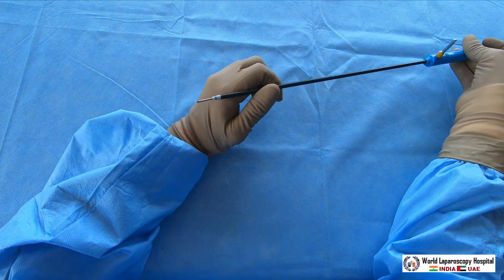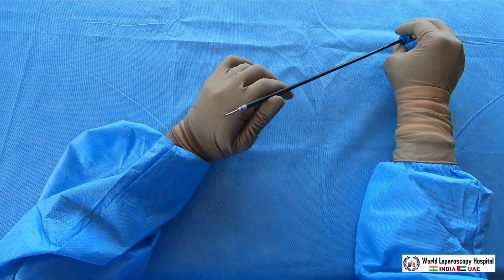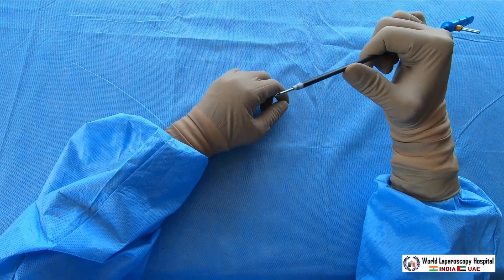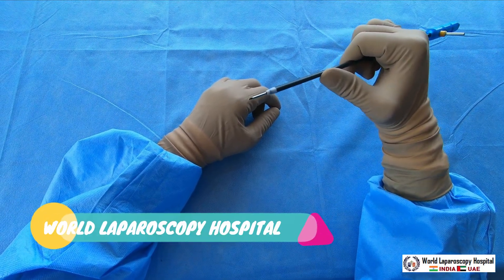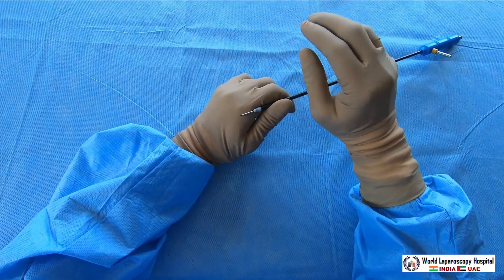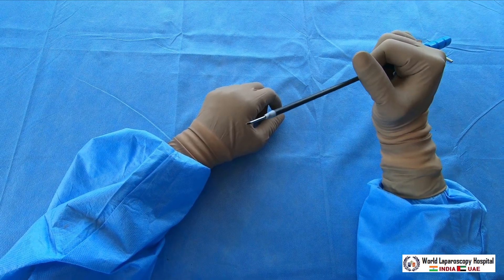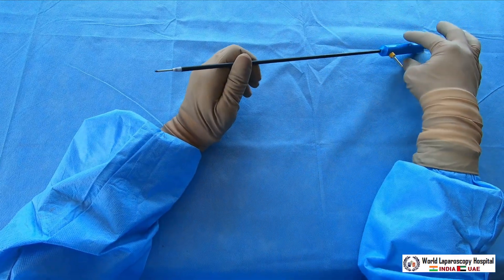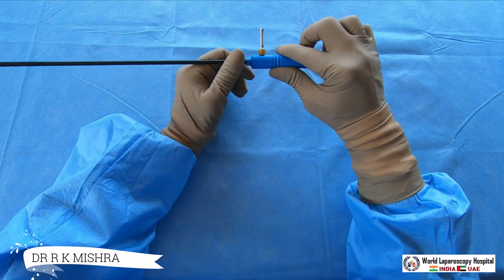You can also attach the monopolar, which has the advantage that while you aspirate there won't be bleeding at the puncture site — but use it carefully. Another danger of this instrument is when you introduce it through the cannula: always enter under vision, because it can accidentally injure the bowel or mesentery. Sometimes the bowel is just in front of your cannula and you may pierce through it, causing laceration or perforation of the bowel.